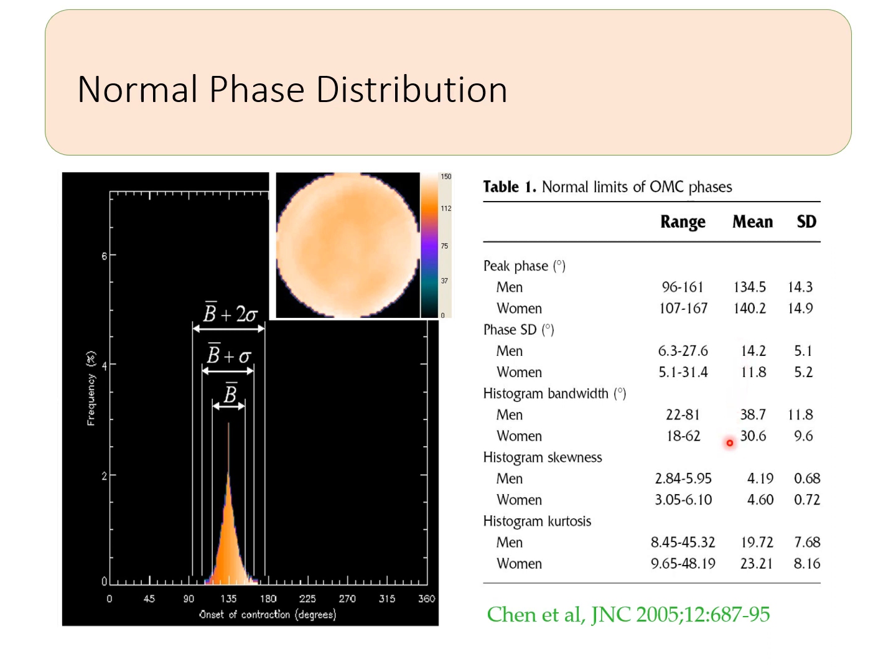Now, understand that this is not the limit of a patient that is in heart failure. This has been confused before. This is the limit between patients that are very normal and patients that are beginning to become abnormal or dyssynchronous. For patients with heart failure, we're going to have to do further analysis, which we'll talk about in a second.